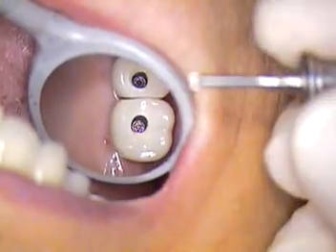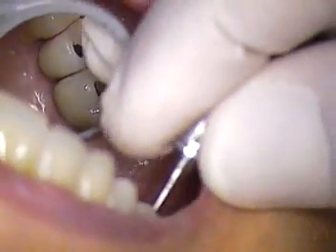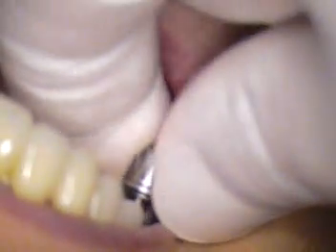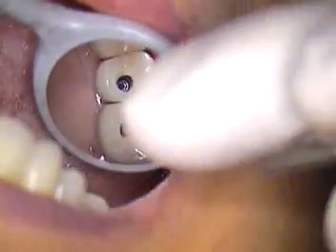As you hand tighten, you're going to feel the threads, and as the threads start to engage, you'll feel some resistance. You want to be able to feel minimal resistance as you go through and hand tighten. Otherwise, you might be putting pressure on a contact or even on other porcelain on adjacent teeth, and you could fracture or set up microfractures to that. So hand tighten gently as it goes down.